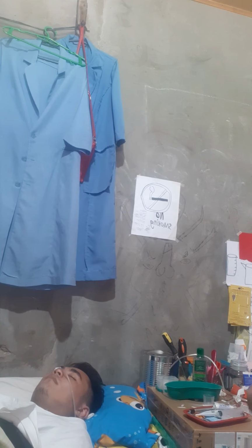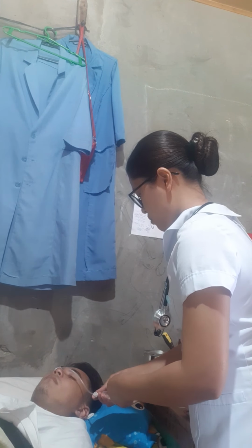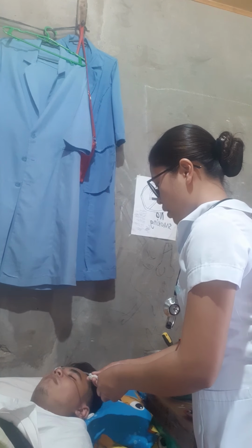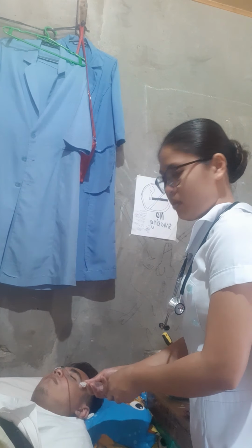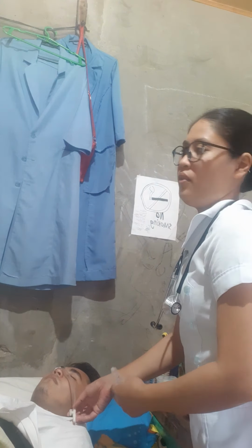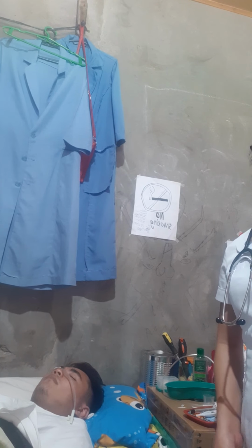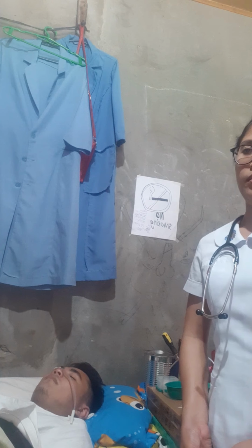Then we are going to aspirate, and if we aspirate 100 ml or more from the previous feeding, we need to report to the nurse in charge, or we are going to refer to the agency before proceeding with the procedure.